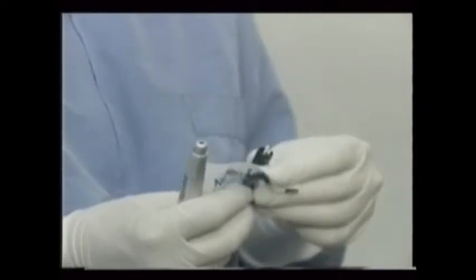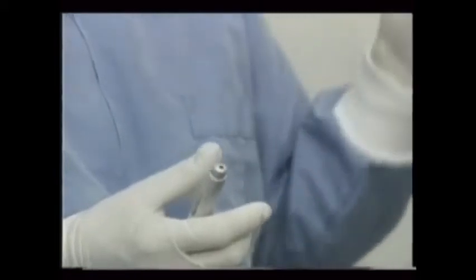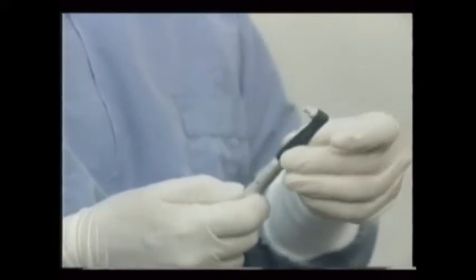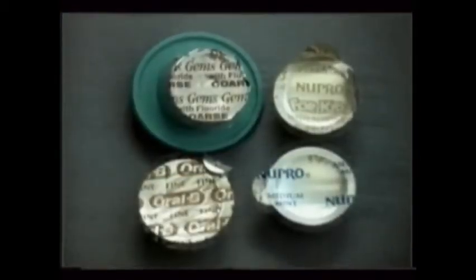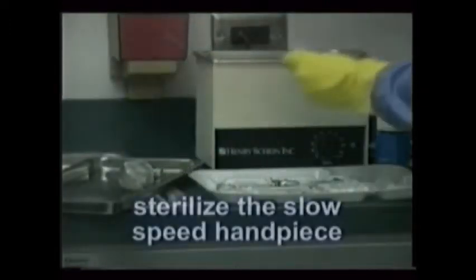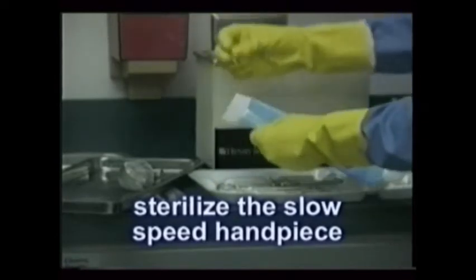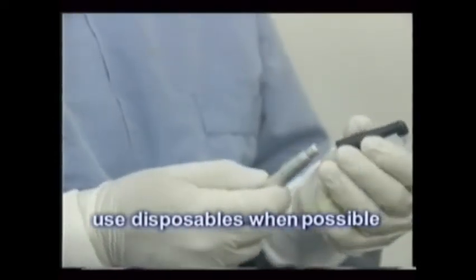After scaling and curetting is completed, treatment ends by polishing the teeth. A slow-speed handpiece with a prophy angle and a rubber cup is used. As mentioned before, paste selection is at the discretion of the dentist or hygienist. Remember that the slow-speed handpiece and its attachments must be properly sterilized and then lubricated before being used. It's recommended that, if available, disposable prophy angles be used.